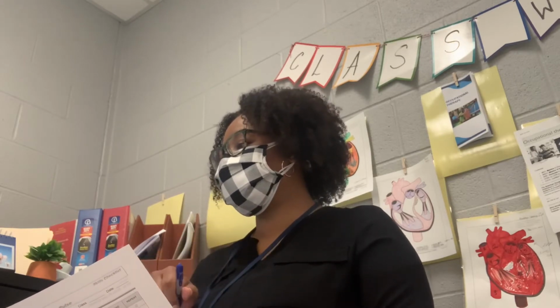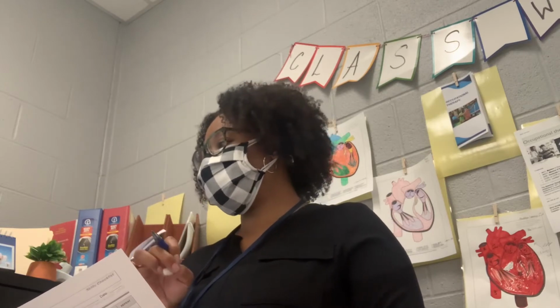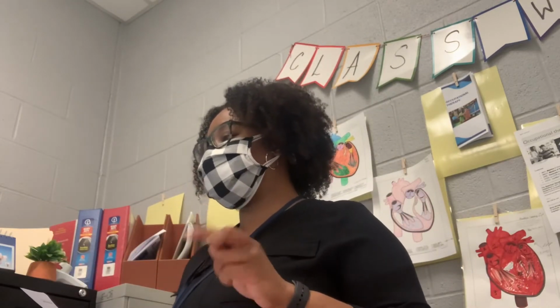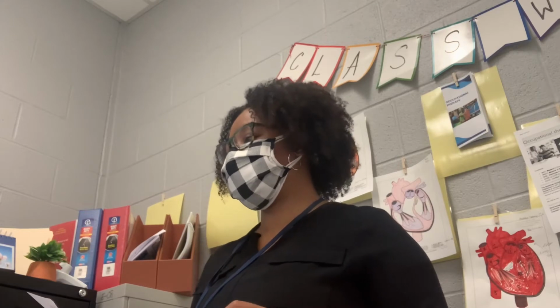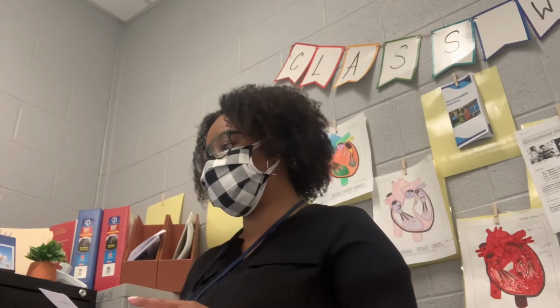So on Friday we did the pulse. Today we will try to work on blood pressure. I know that the distance learners don't have equipment at home, but I'll show you how to do it. Therefore you will record the date, the time in military time, the pulse, and the respiratory rate. So for distance learners, that's what you will record, what is in green on Teams here.